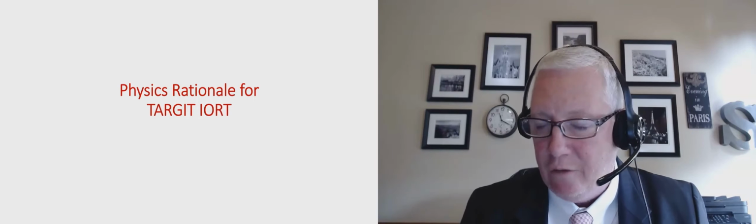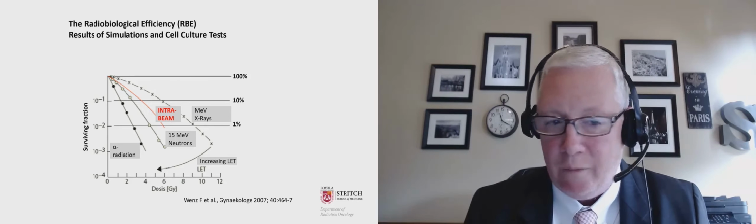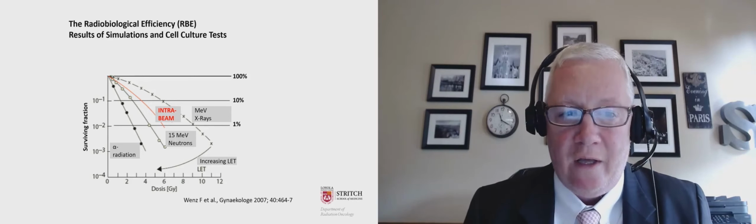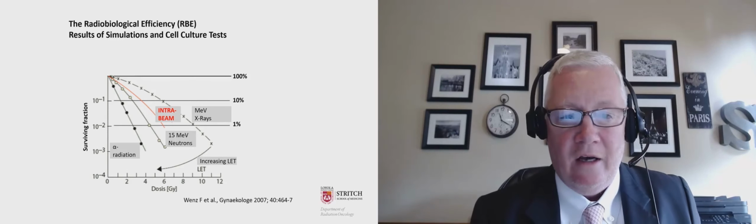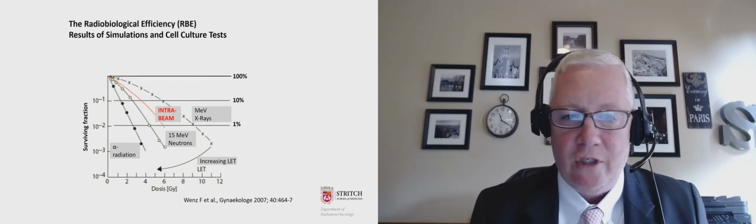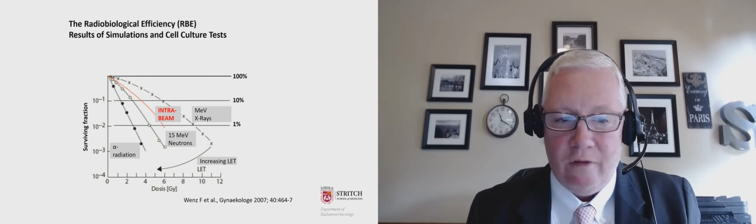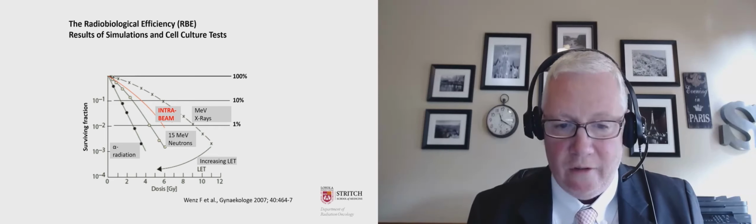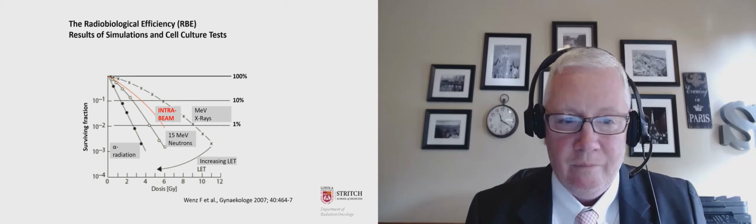Is there a physics rationale? So physics is how radiation is delivered. And actually, the soft radiation works better than radiation from the outside. It has a bigger biological effect. So for the same dose, you kill a lot more cancer cells. Again, this is kind of a busy physics slide, but it shows that Intrabeam, or the Zeiss machine, or soft radiation has a bigger effect on cells than the typical radiation we deliver after breast surgery, which again may be why this seems to work very well.